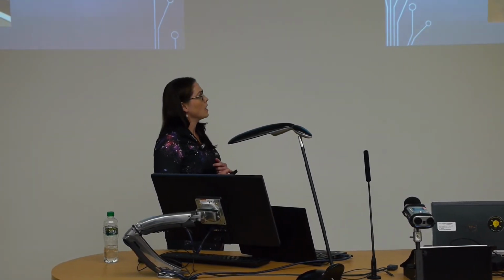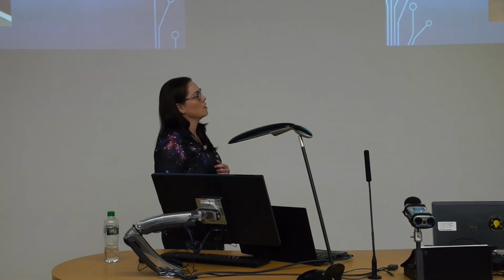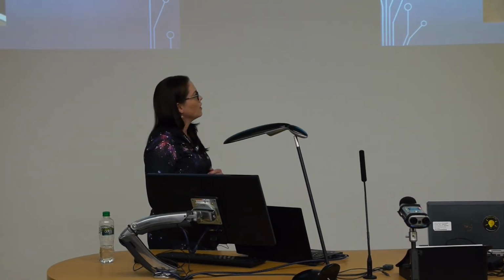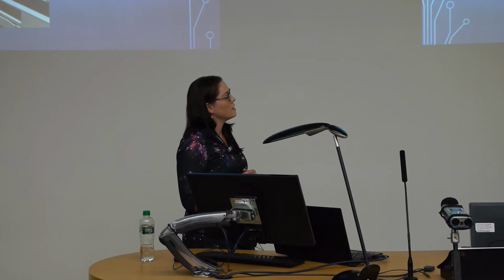So this treatment head produces photons. That's pretty standard. What we have here is an amorphous silicon detector. So this now detects these MV photons. So now you have the patient on the bed, and you can look at what comes out the other side, and then perhaps you can look at what happens going through the patient. And then at 90 degrees to this is an X-ray source and a detector. So this is an onboard CT.